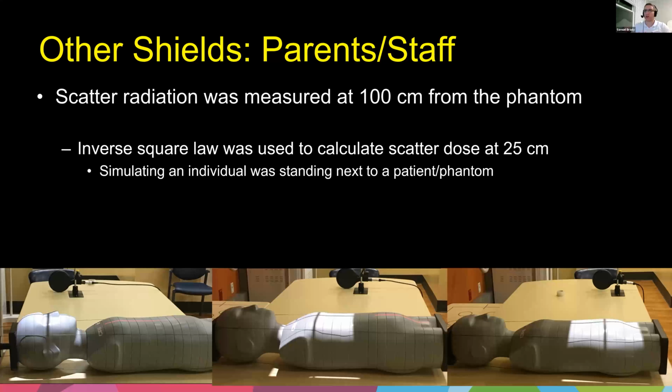I'm always very conscious about keeping doses low for really little kid head CT scans, just because that's where most of their bone marrow is. But no, there is nothing we can do to shield it. So we shield by using good techniques.